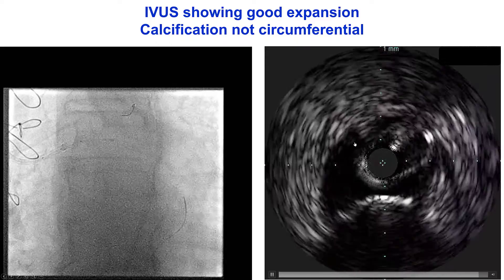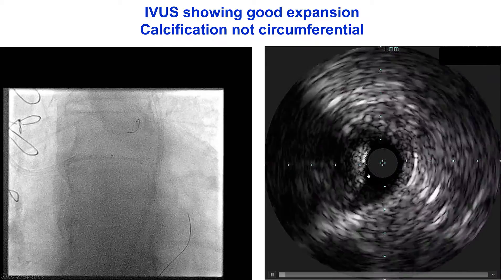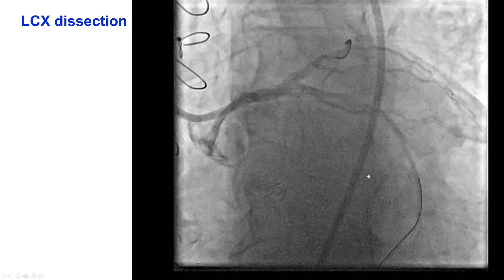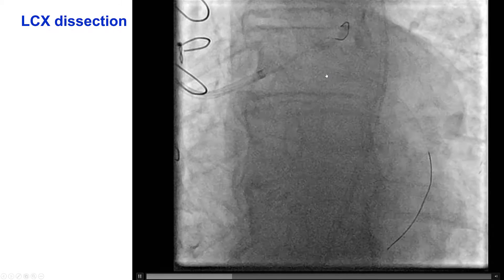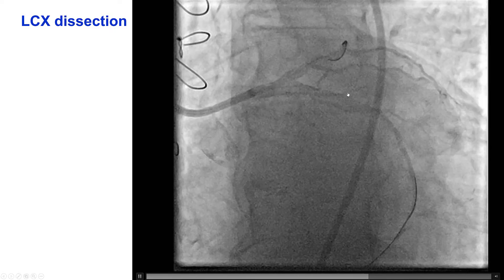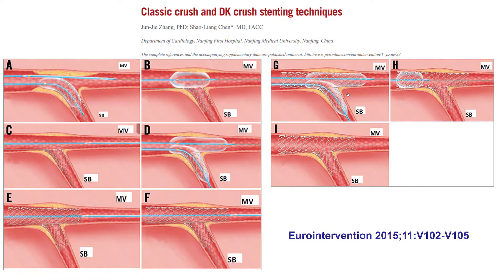This is the LAD wire, and this is the left main without significant disease. We did, however, have a dissection in the circumflex because of the aggressive pre-dilation efforts. We decided to do the double kiss crush technique for multiple reasons: we had a big dissection into the circumflex, so we didn't want any chance of losing wire access to that vessel by stenting first into the LAD, and there was also similar vessel size in both the LAD and the circumflex.